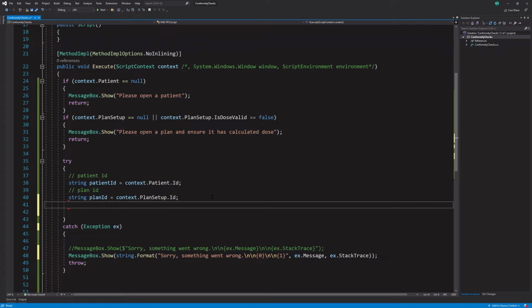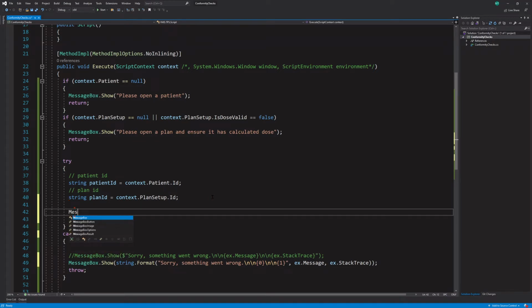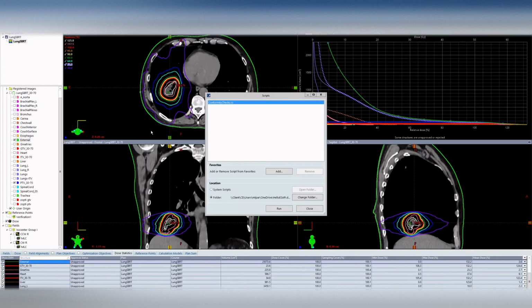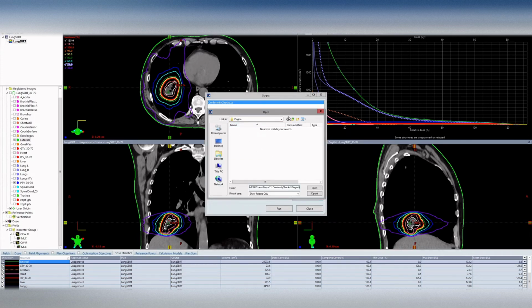Let's write MessageBox.Show, and let's just say "I'm working." Okay. So we've saved this, and then I'm going to pause the video and pull up Eclipse. I'll be back in just a second. All I've done is switch over this folder so that I'm in my dev, repos, conformity checks, plugins.